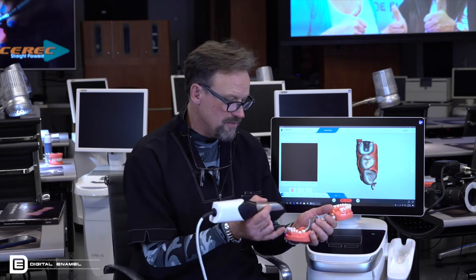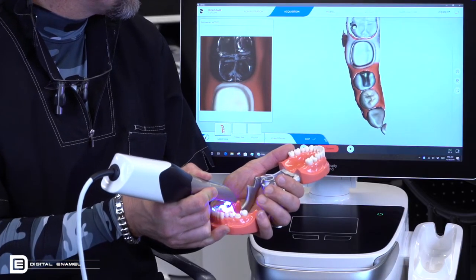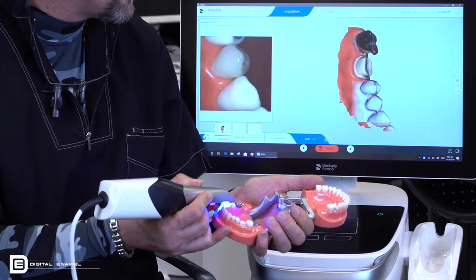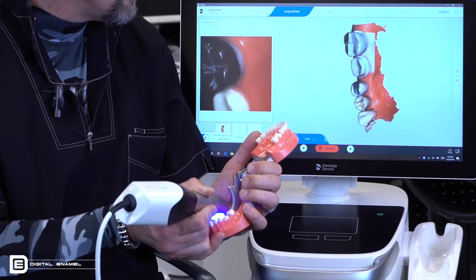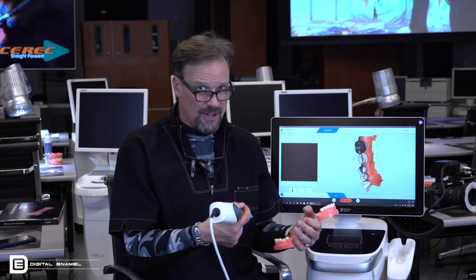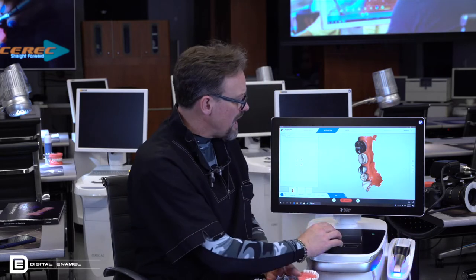So I've got my pivot point. I'm going to go over the occlusal surface, roll it to the buccal. I'm not thinking about holes at all. If I miss something, I don't care. The tongue just instantly got in the way, I don't care. I did the occlusal, I rolled it over the buccal, did the lingual, and I'm going to stop. The camera comes out of the mouth, you could set it down, and then you're going to evaluate.